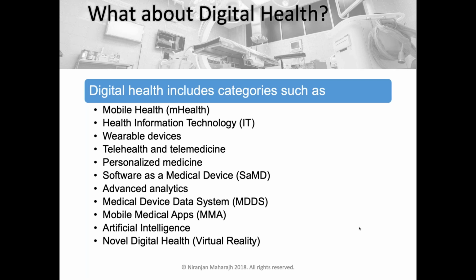But there's this aspect of software as a medical device. There is no hardware. There is no instrument that the software runs on. So software as a medical device, that's the blossoming field. This is where you see AI, a lot of diagnostics, a lot of machine learning. So the FDA is creating new regulations in this space.